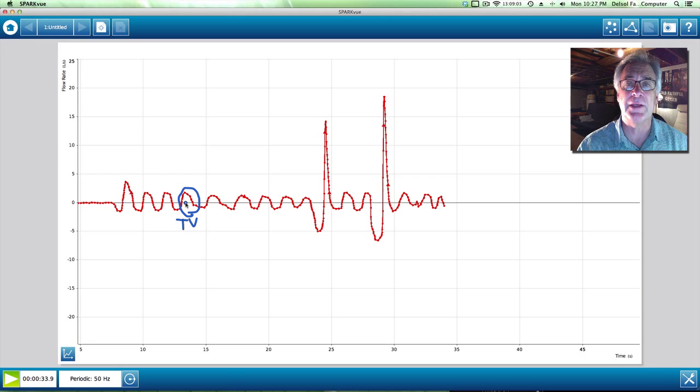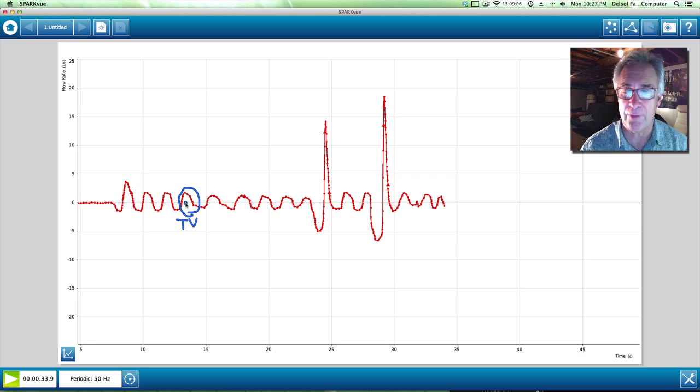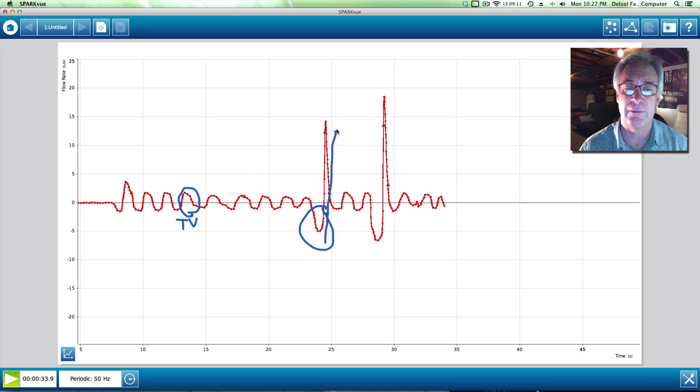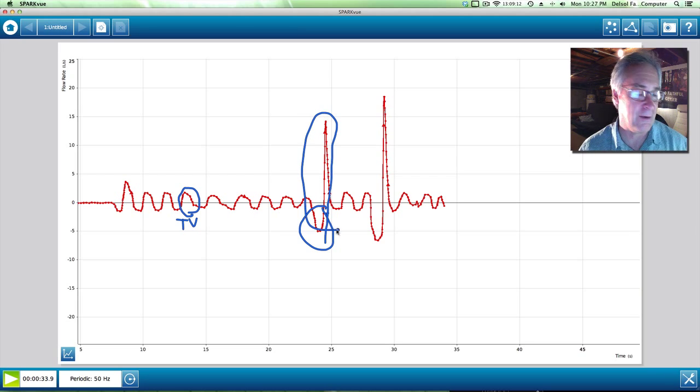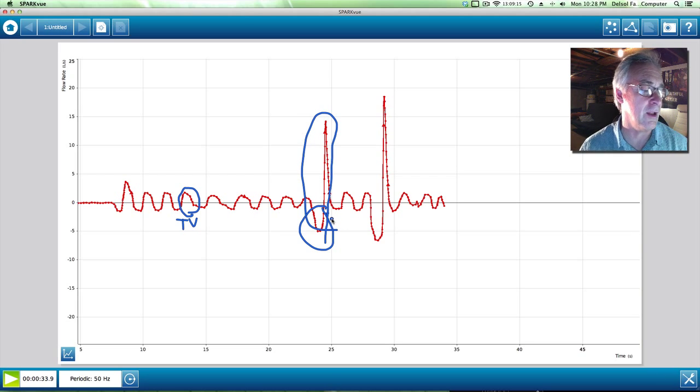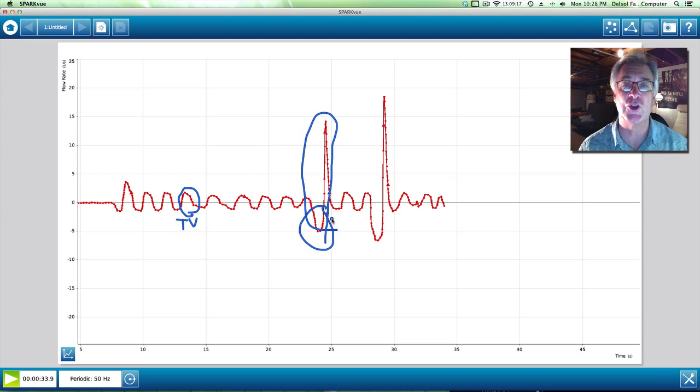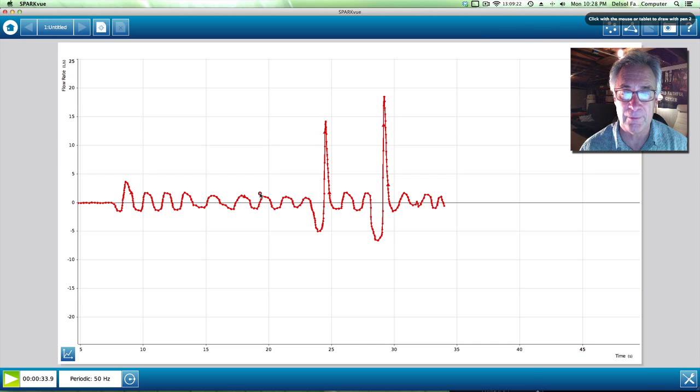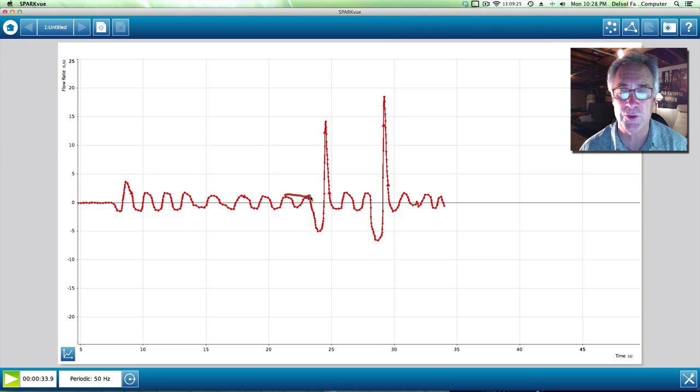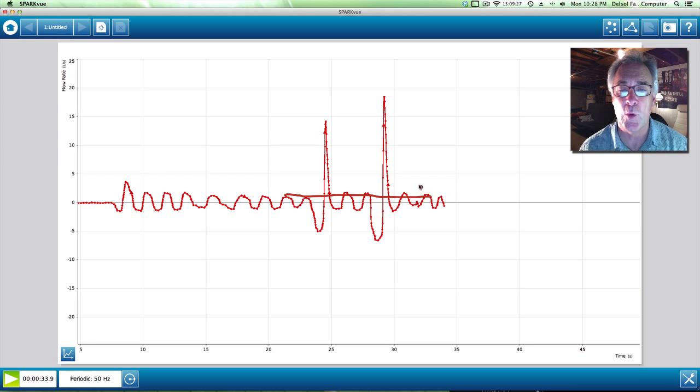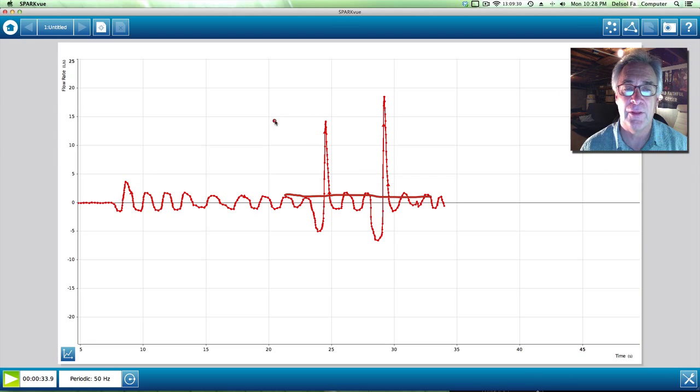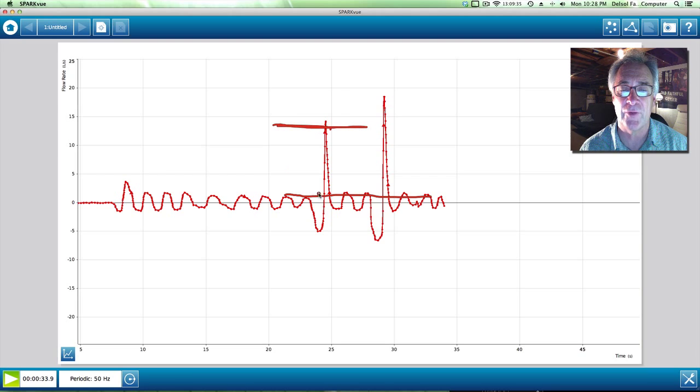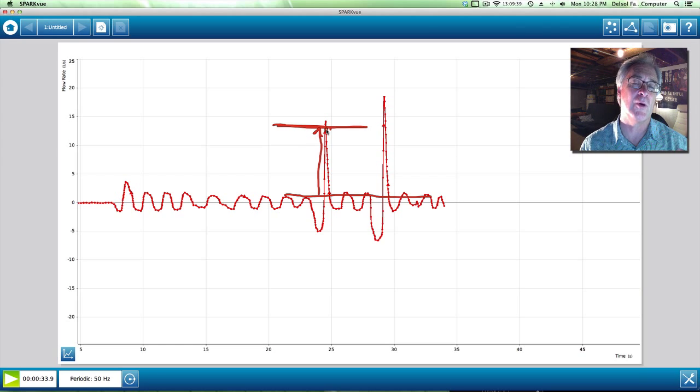And then what I did is I took in a breath right here and then I forced it out right here. And this is called the expiratory reserve volume. That's basically if we have this line right here run straight across the tidal volume. This is what your normal breath is. When I exhale, this is the reserve that I have in my lungs right across here, basically from here to here. So that tells you what my reserve is.